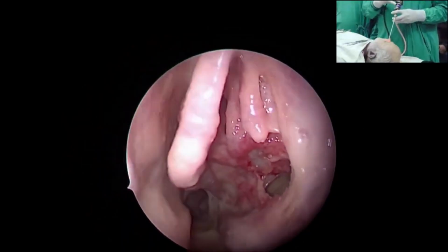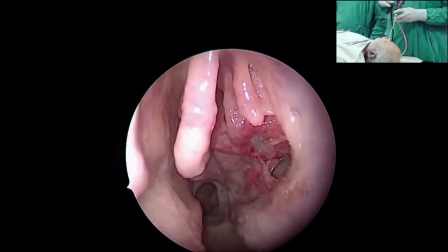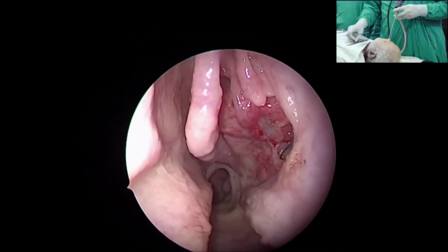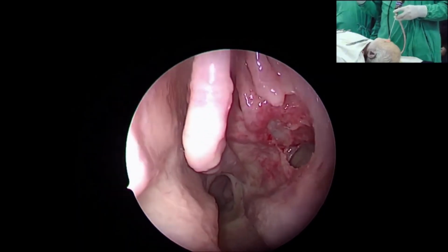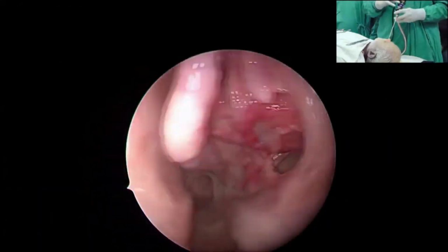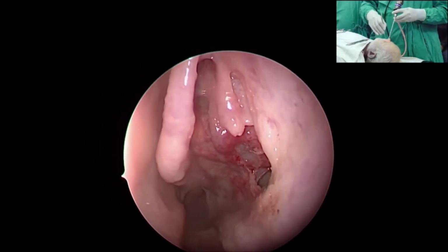So which degree endoscope are you using right now? Right now, wide angle 0 degree. But I tell you, for this question, I use only 2 telescopes, 0 and 70. And for that matter, how I'm used to, I find 70 degree to be more versatile for the reasons I'll tell you. And my message is, we must get used to the angle telescope to carry out the visualization of certain different difficult areas, making them under vision to carry out the work without giving complication.